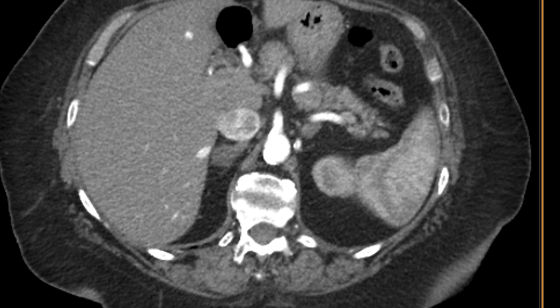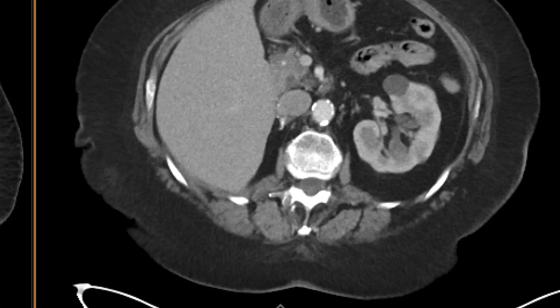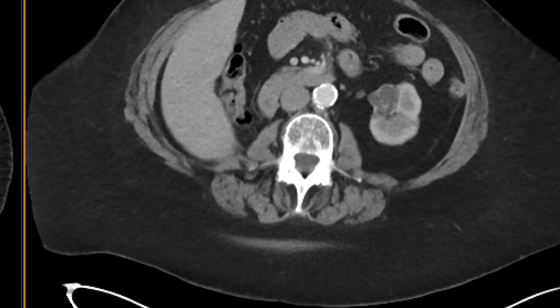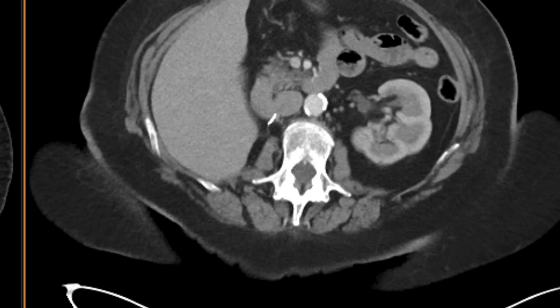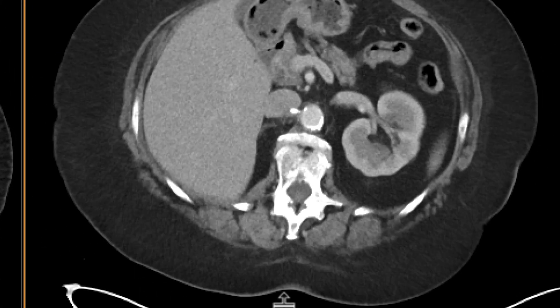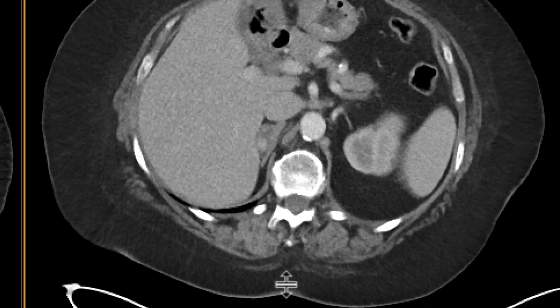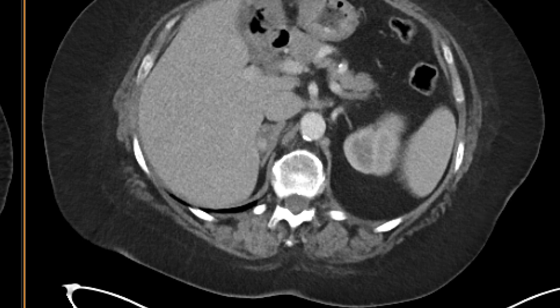We fast forward and resect that right renal neoplasm. But what we find a couple of years later is a very discrete enhancing nodule that is now present within this pre-existing adrenal mass — this pre-existing adenoma.